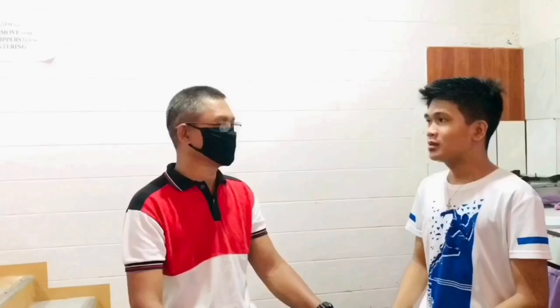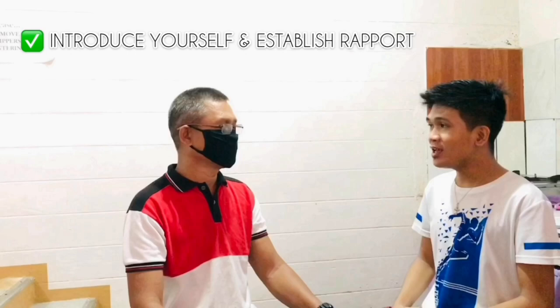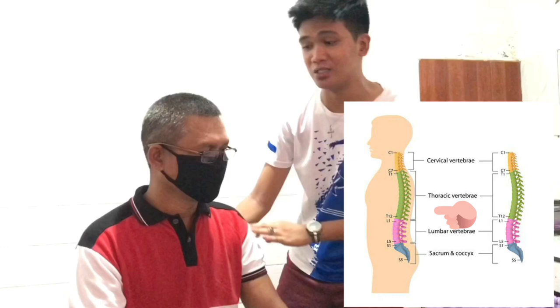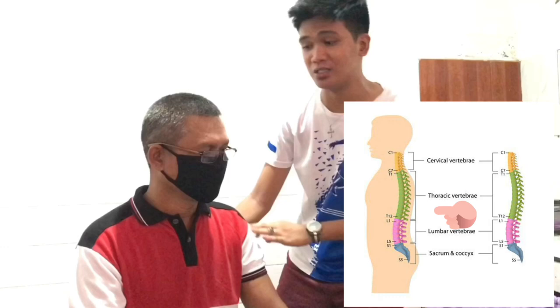Hi sir! Good day! I am Dodi Big Arma and I am your physical therapist for today. How are you? I'm going to measure the amount of movement that you have at your upper and lower back, sir — this is what we call the thoracic and lumbar region — to see if it differs from what is normally expected.